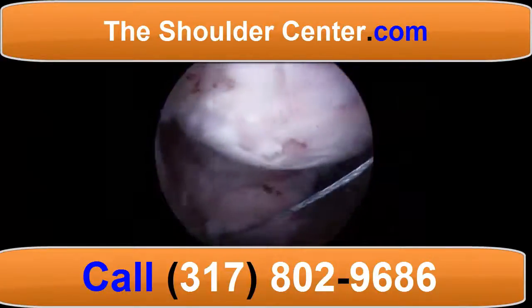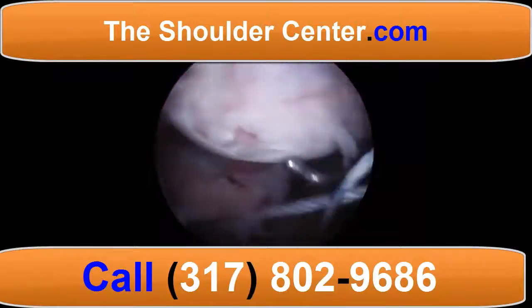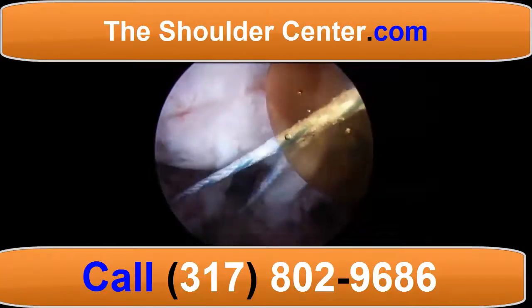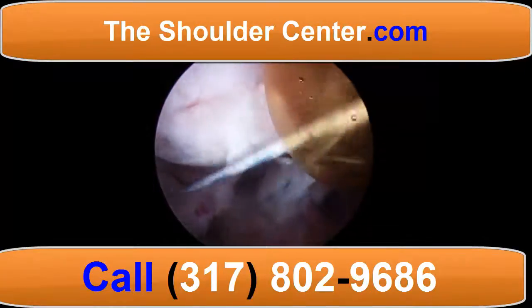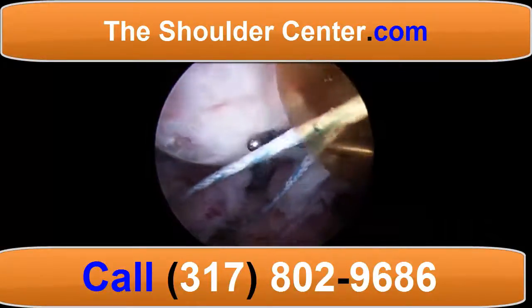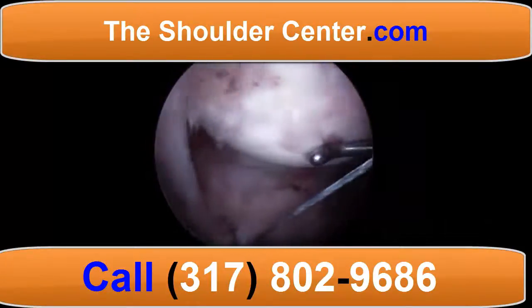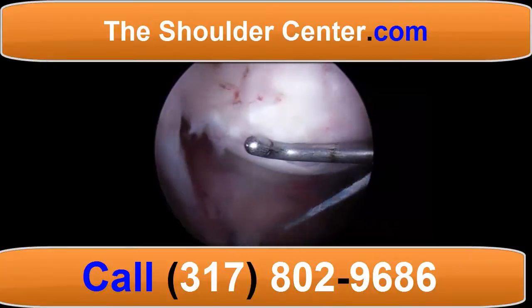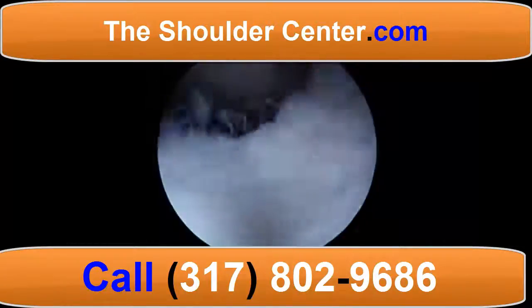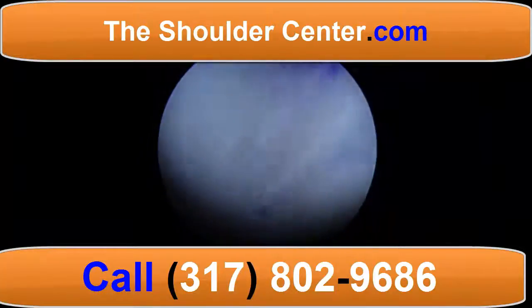Now we measure the dimensions for the superior capsular reconstruction and transfer these to the graft on the back table. Once the graft is cut to these dimensions, these sutures are weaved through the medial aspect of the graft and the graft is then delivered arthroscopically.